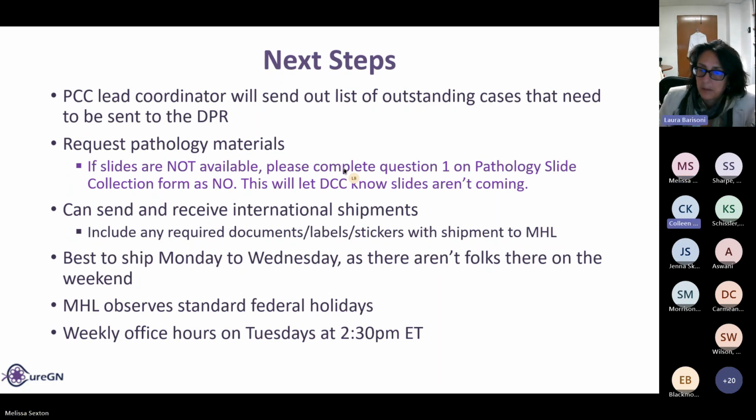Also, the slide copy uploads should be by patient. So that thing where you put the slides down on the photocopier, that should also be by patient, because that actually goes into HaloLink and is associated with the patient, so the pathologist can look at it. So it's cleaner, less confusing. I don't have to make multiple copies if it's once per patient.